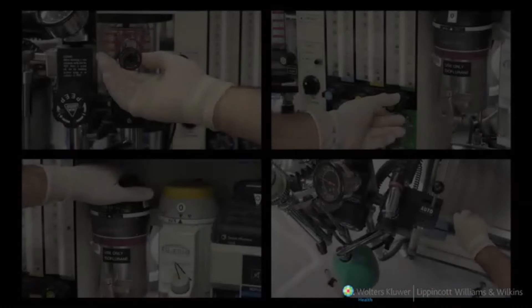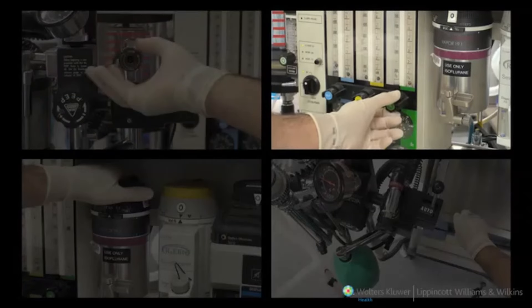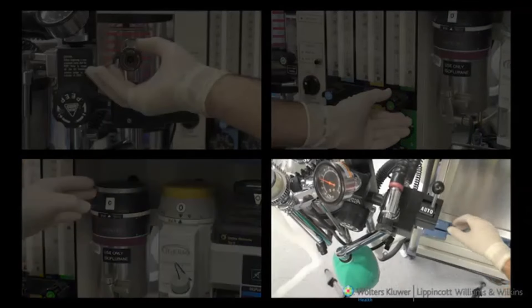In summary, these errors can be prevented by developing a systematic approach to opening the adjustable pressure limiting valve, having an adequate oxygen flow, making sure that the vaporizers are closed, and selecting manual ventilation on the anesthesia machine.